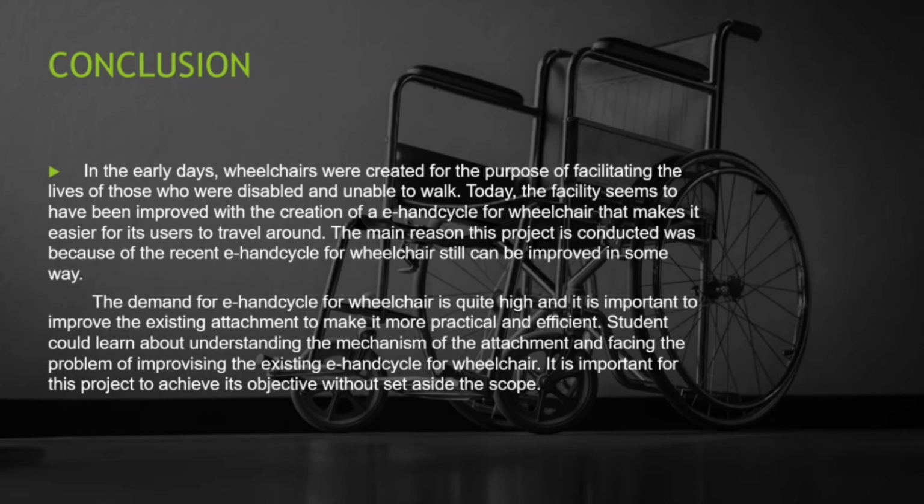The main reason this project is conducted is because the recent E-Handcycle for wheelchairs can still be improved in some way. The demand for E-Handcycle for wheelchair is quite high, and it is important to improve the existing attachment to make it more practical and efficient.